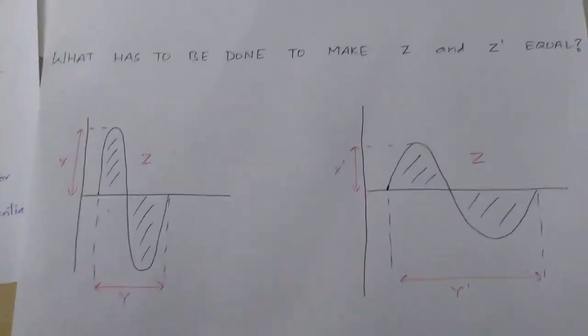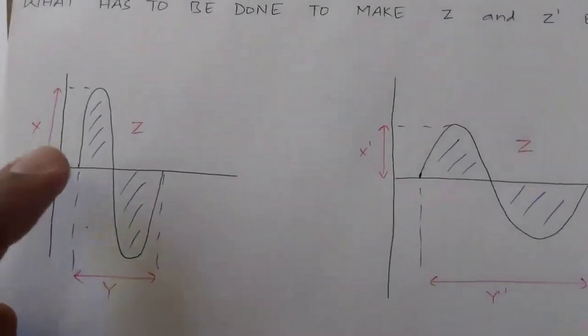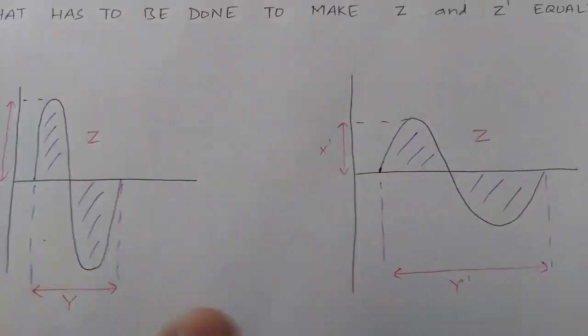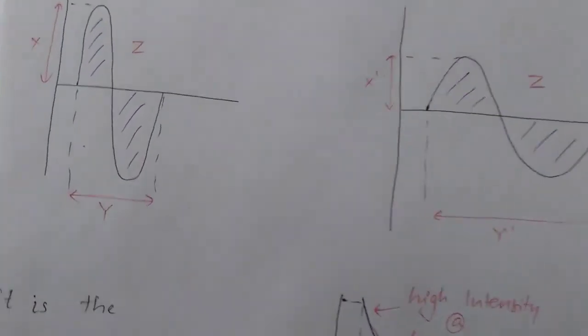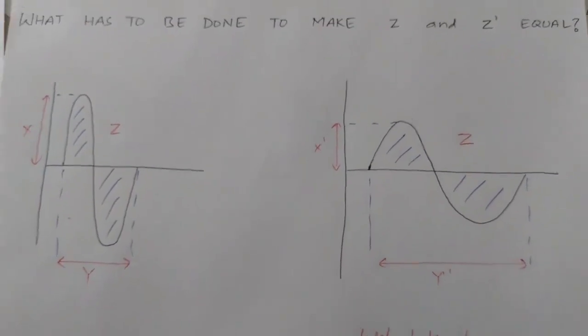If we look at this, to achieve the same amount of charge that gets transferred, we require higher intensity in case of Faradic, but the intensity required is lesser in case of galvanic current. Suppose, when do we need more intensity to stimulate?